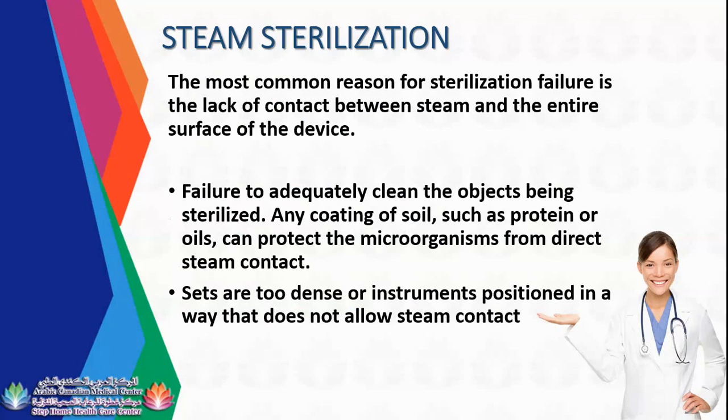The most common reason for sterilization failure is the lack of contact between steam and the entire surface of the device. Another is failure to adequately clean the object being sterilized, any coating of soil such as protein or oils. In your prep and pack preparation area, sometimes you are putting oil or lubricants on the instruments. Once you put oil or lubricants on the instrument, you need to remove the excess oil so that it will not contaminate the pouch. You need to remove the excess oil by wiping with disinfectant wipes. Also, sets that are too dense, or instruments positioned in a way that does not allow steam contact.